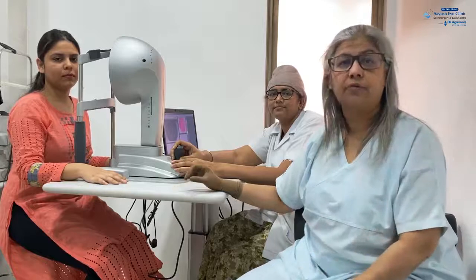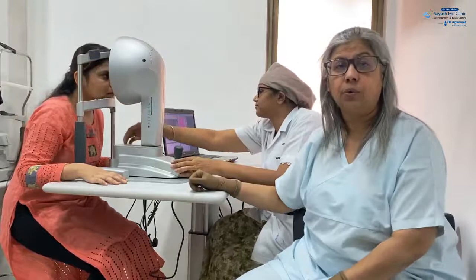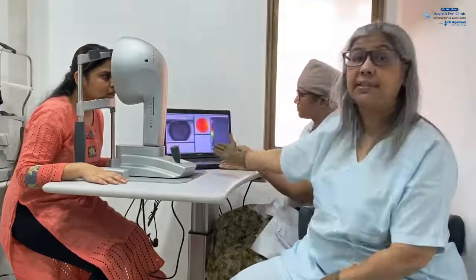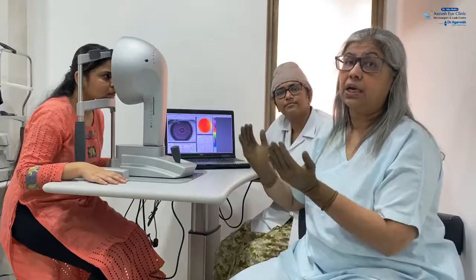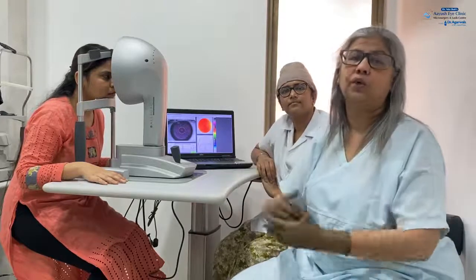Once the patient is seen on the Pentacam and we are sure there is no risk in the surgery at all, it is a perfect candidate for laser, we take the patient up on this machine, which is called the Vario, which takes 22,000 points and gives us scans like this, which is directly transferred onto the laser machine so that we can carry out the treatment on those 22,000 points in one cornea which are scanned and give a very smooth and regular treatment for Contoura.